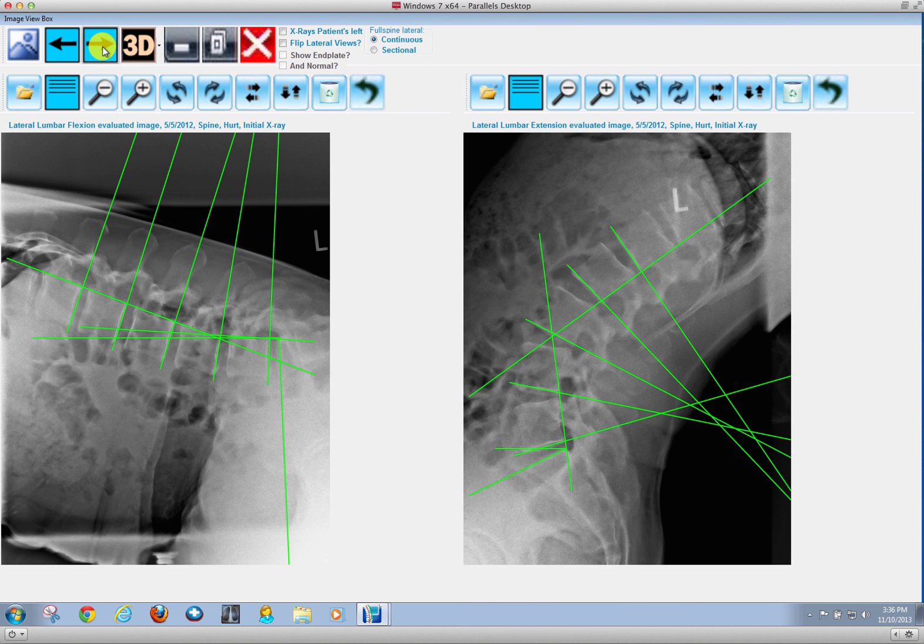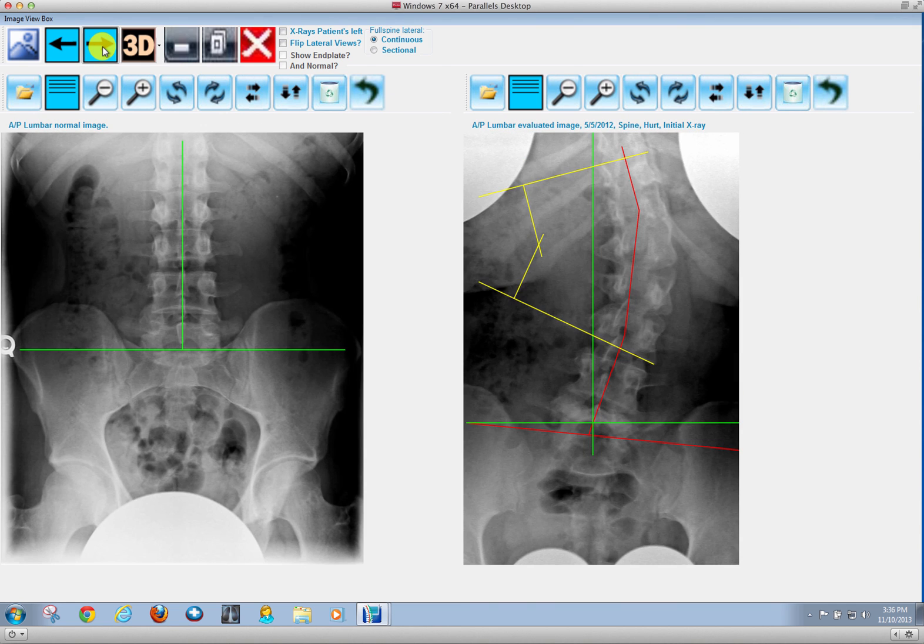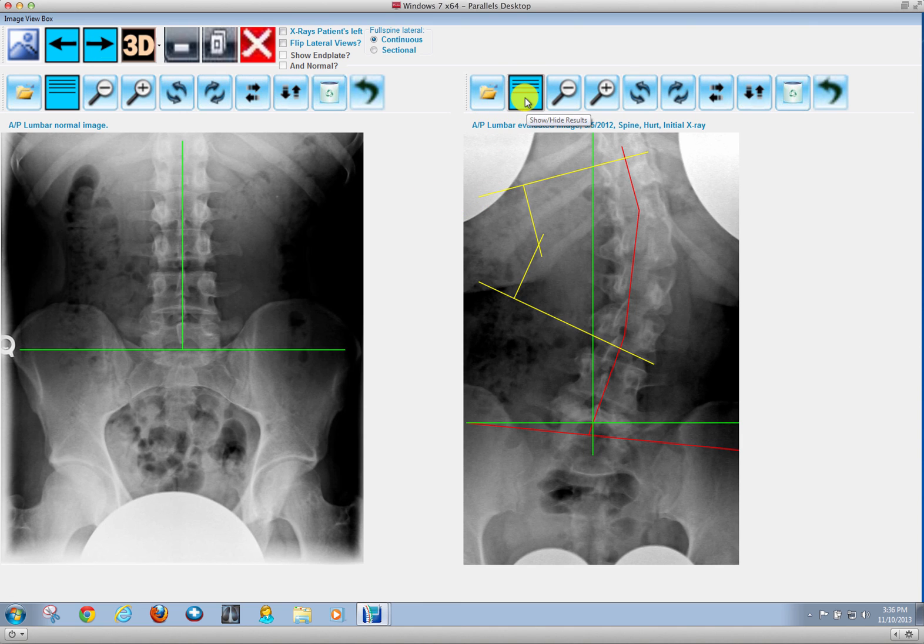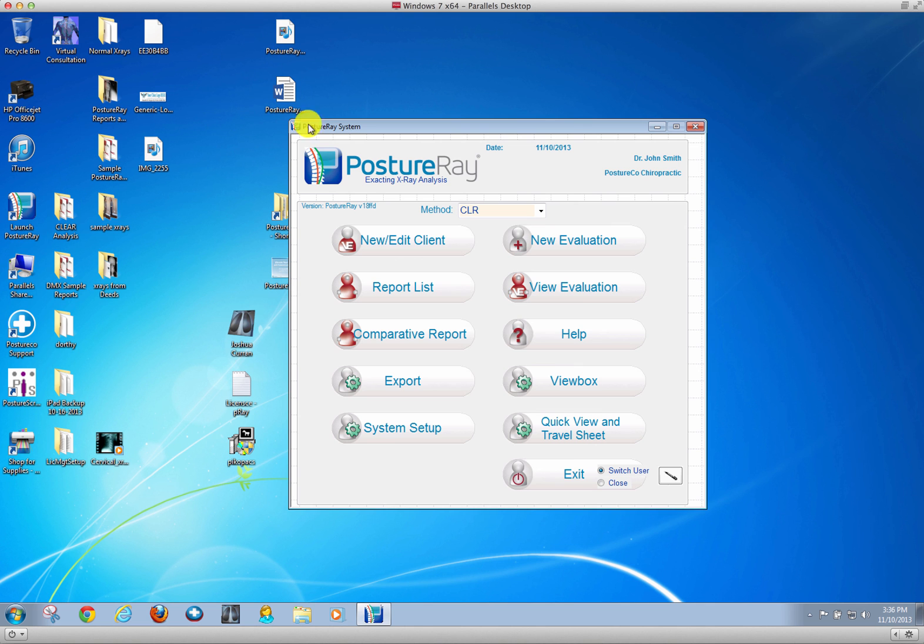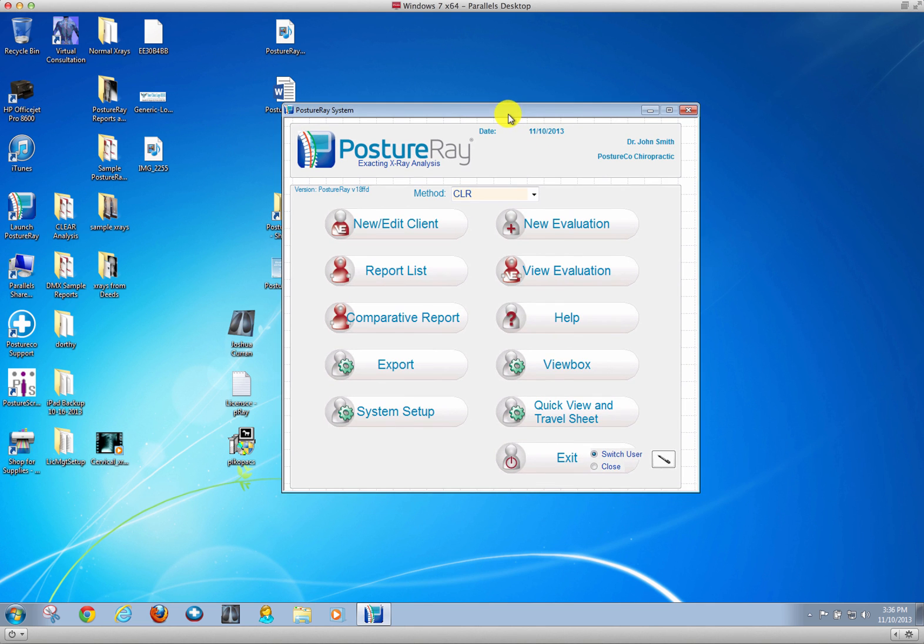You can do flexion extension, scoliosis. And if you forget what the values are, you just simply click and there are all your values. Once you're done with that, you're going to have report of findings ready for the patient.